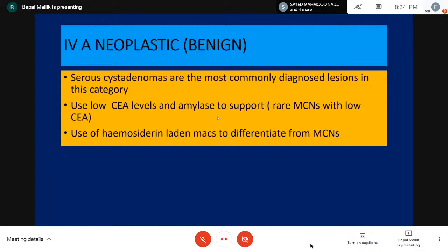I told you that 50% of mucinous cystic neoplasms do not show clearly grossly visible mucin or even microscopically visible mucin where you are absolutely certain. So it is the differentiation between those grossly mucin-poor mucinous cystic neoplasms and serous cystadenomas where, if you find hemosiderin-laden macrophages, it is believed that in the walls of these serous cystadenomas there are blood vessels. I told you they can be hypervascular, they bleed, and there is a lot of hemosiderin. So that hemosiderin comes into the cyst fluid. So when you differentiate between these two, hemosiderin-laden macrophages can be of help in supporting a diagnosis of serous cystadenoma.